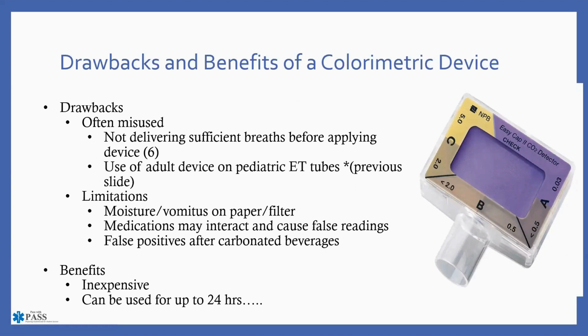All right, so drawbacks and benefits of the colorimetric device. Drawbacks: often misused. If you read the package insert, you're supposed to deliver 6 tidal volume breaths before you ever put this on the end of your endotracheal tube. The rationale for that is hypothetically the patient had just consumed a carbonated beverage. You now put the cap on there and you end up getting the CO2 from the carbonated beverage that they were drinking when they had their cardiac arrest event. So there's potential for some misinformation if you're not using the cap correctly.